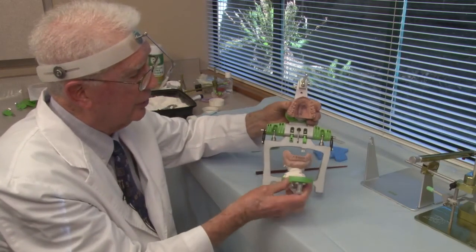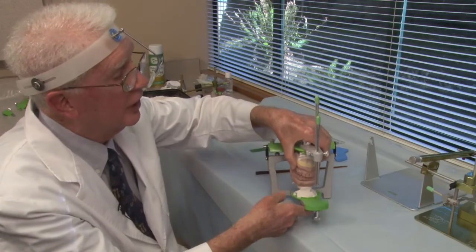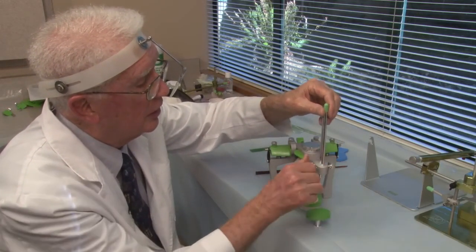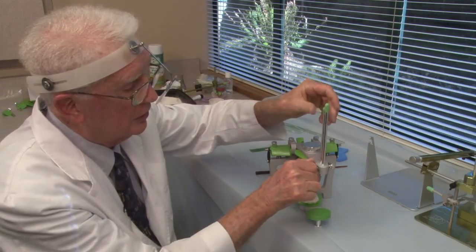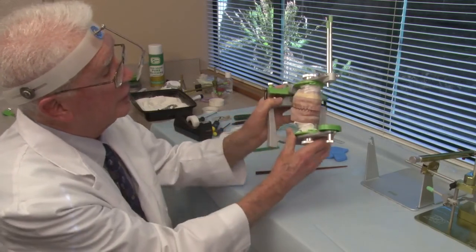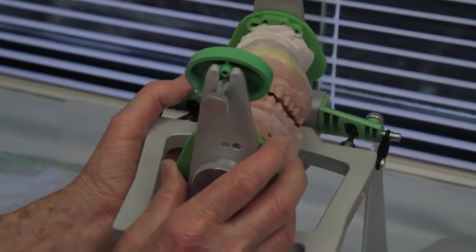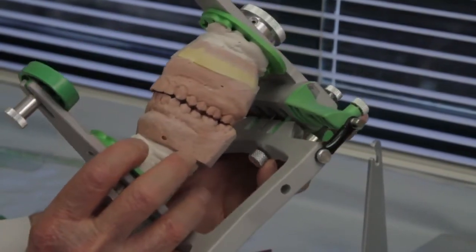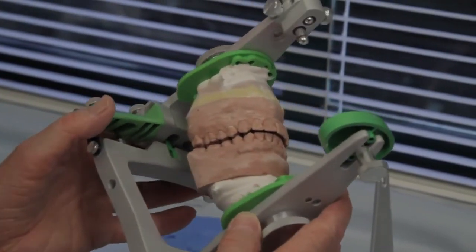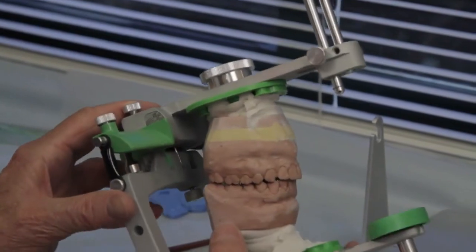So if I close the articulator to first contact, let me get this pen out of the way so you can photograph it. So if I close it down to first contact, this is what you have. Notice that there's an open bite all the way around. The teeth don't come together all the way around. The only contact is in this area here.